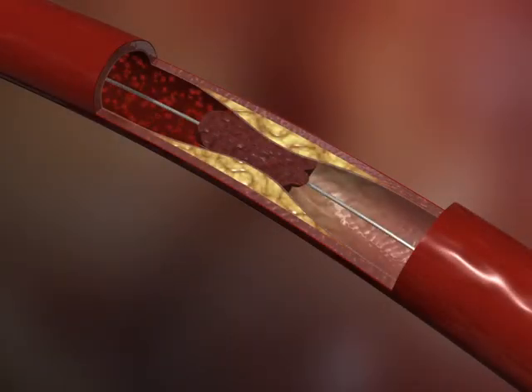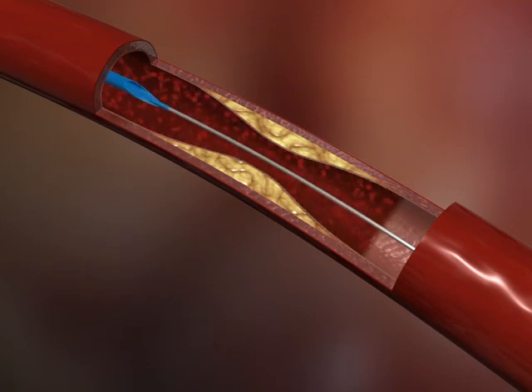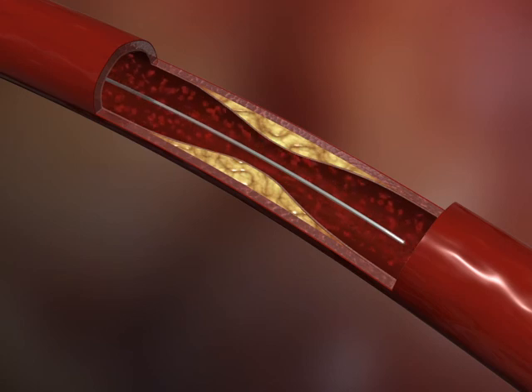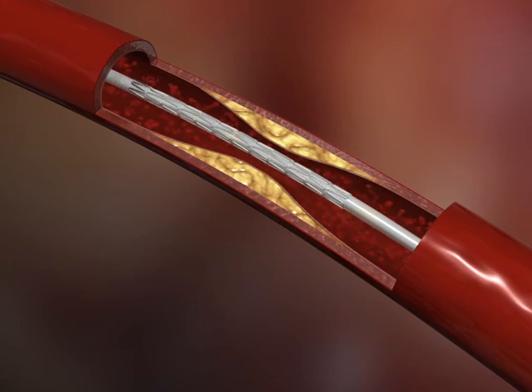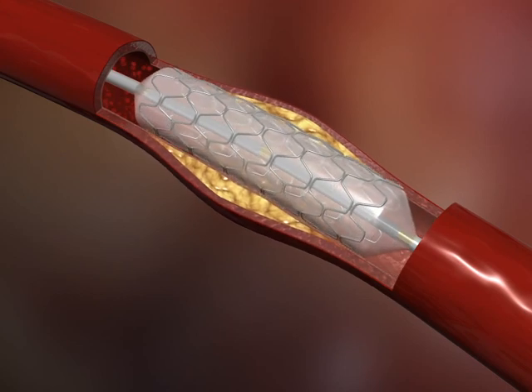After the guide is passed, the Hunter catheter is inserted until the occlusion is crossed. Aspiration of the thrombus is done manually while the catheter is removed. The radiopaque marker of the catheter, placed 1 centimeter from the end, makes it possible to locate the catheter's aspiration zone. The stent is then implanted once the thrombotic material is removed.